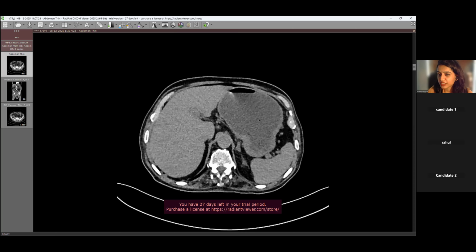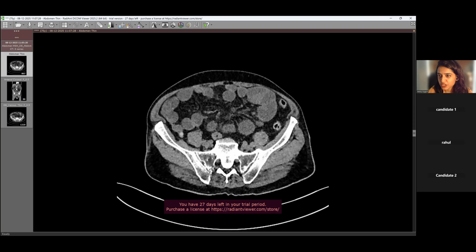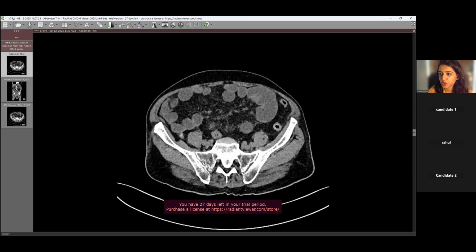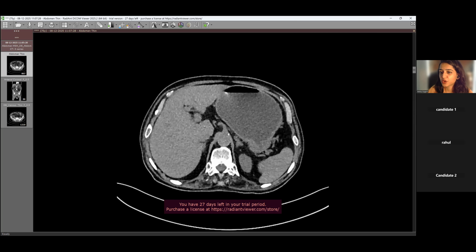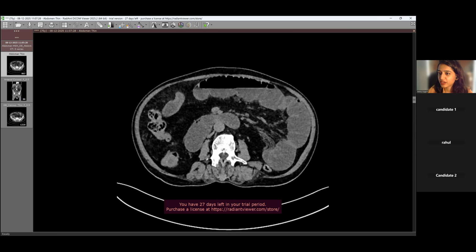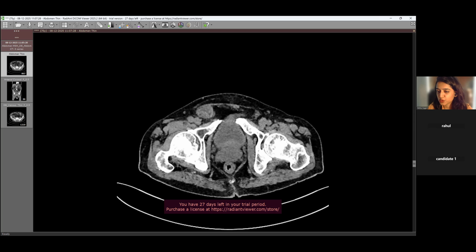This case is quite classical, and commonly we get asked about hernia causing intestinal obstruction. So it's better to aim for a full score on this. And I think you mentioned all the points for ischemia, you said pneumatosis and everything else. You can also add that if the patient is on the table, I would immediately get a contrast study because we do need to rule out venous ischemia and other things. That's about it. Everything you mentioned, pneumoperitoneum and everything that you have to look for.